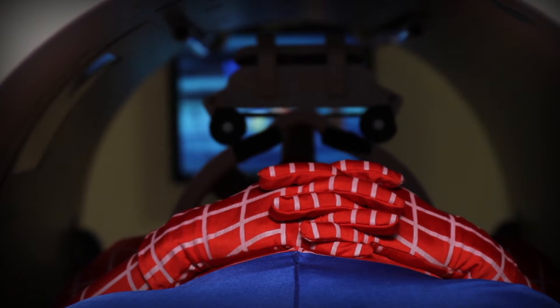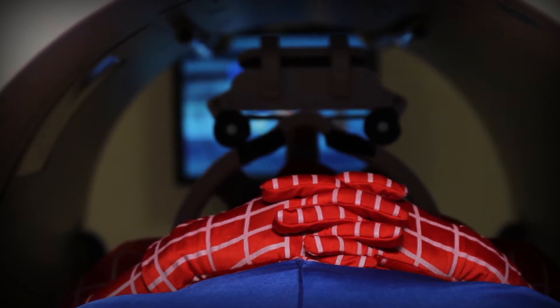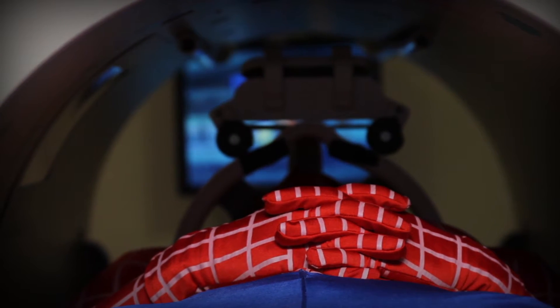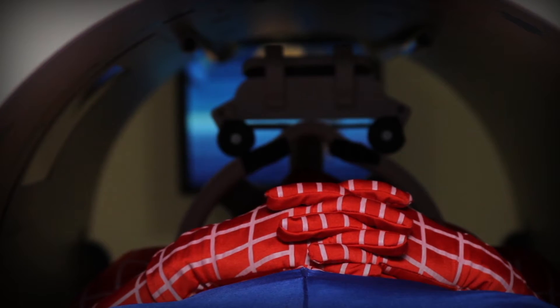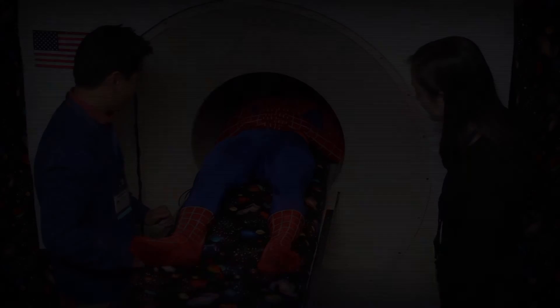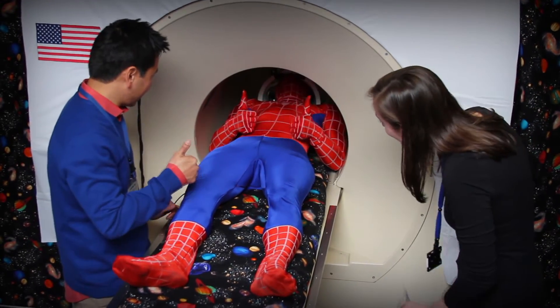Once you are in the tunnel, you will hear the spaceship making noises. Your only job is to stay still and watch your movie during the noises, just like Spider-Man. Each noise will last about five minutes and then you can take a break. Spider-Man really liked watching the movie in the spaceship.